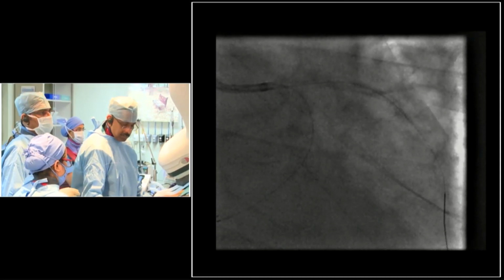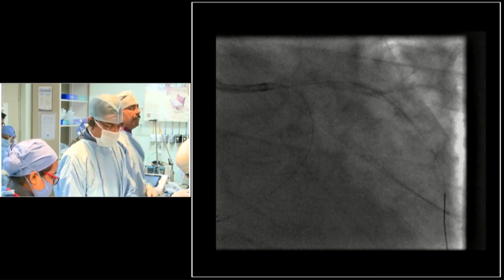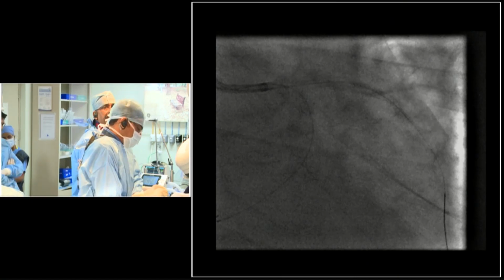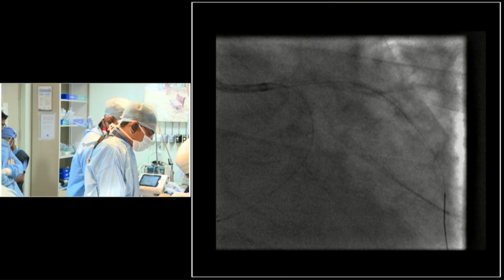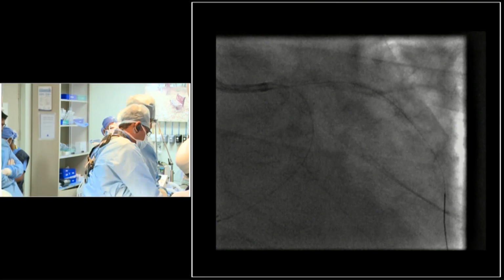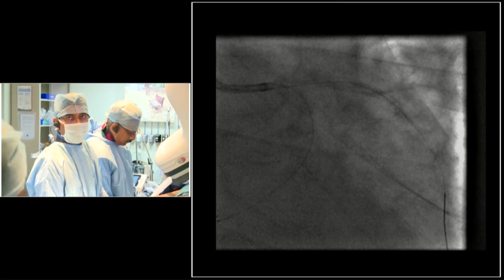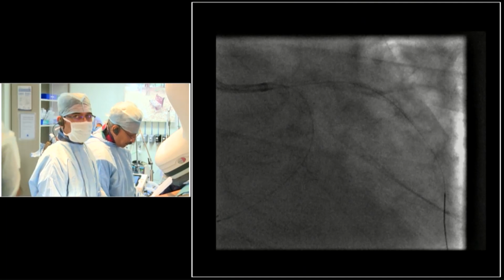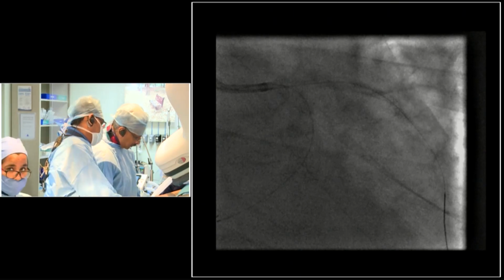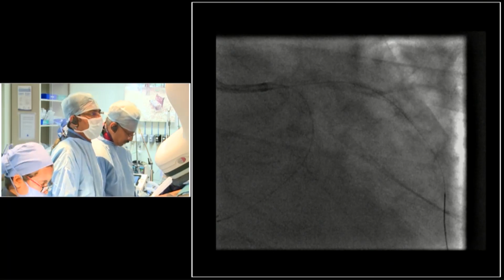Maybe we can just see whether we have made some more cracks in that. Quick IVUS for 2 minutes will do it. Yeah, sure. Keep the stent ready, okay. And we have 3 balloons. You have plenty of time, 20 minutes more. So we do this IVUS. The patient is stable, so we thought we do one more IVUS run. No problem, sir.